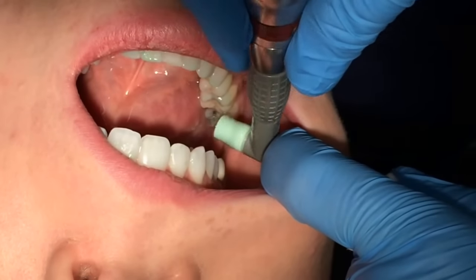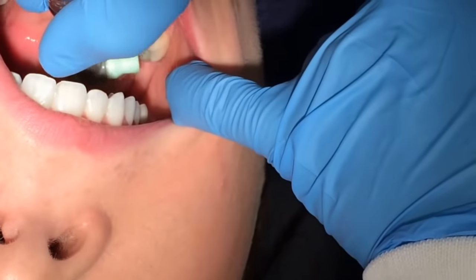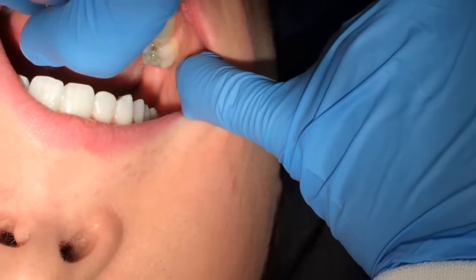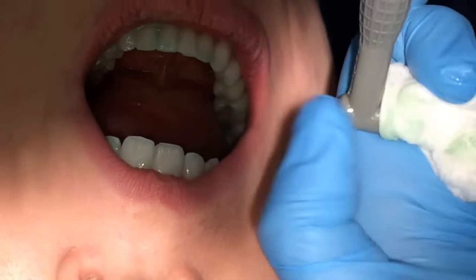One tip: when it gets clogged, I just run it across my 2x2. One tip I've heard is to start on the lingual, as that's where most of the saliva gathers when polishing.